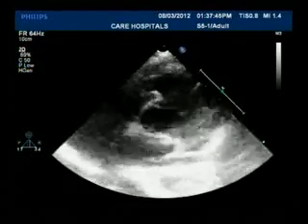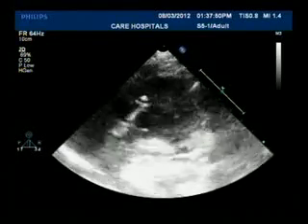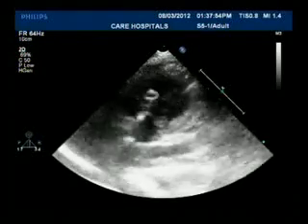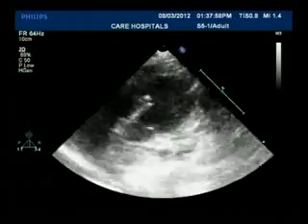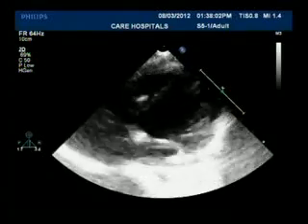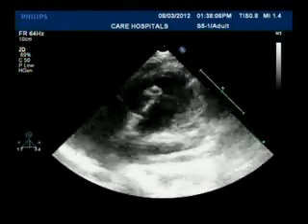So our RV disc is very close to the membranous septal aneurysm over there. For this process, are you using only echo or a combination of echo and fluoro? I use a combination of the echo as well as the fluoroscopy here. Okay. You can see the RV disc is nicely over there. Can you please apply color over there?